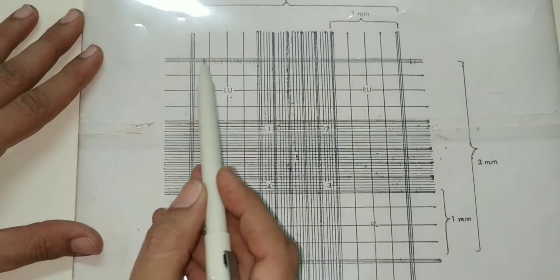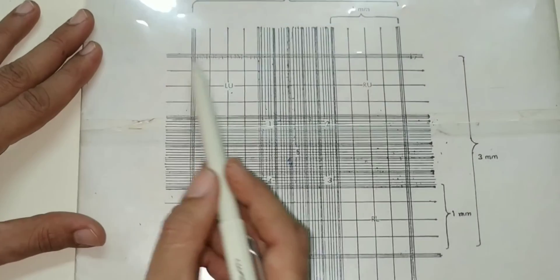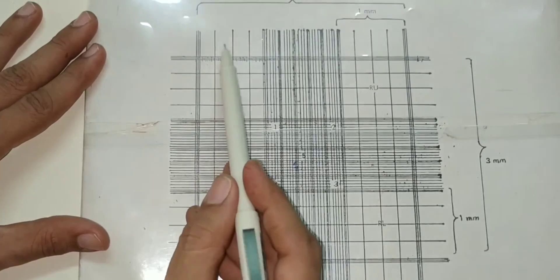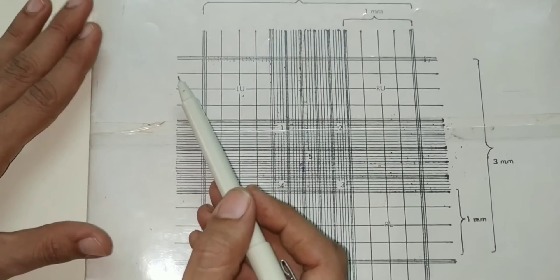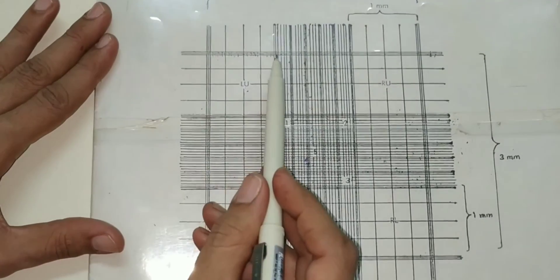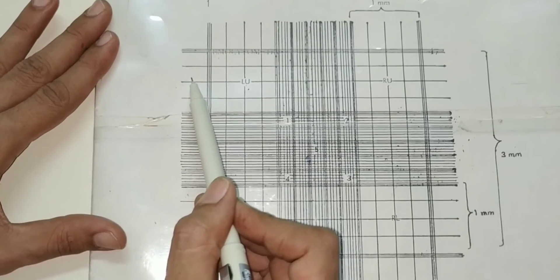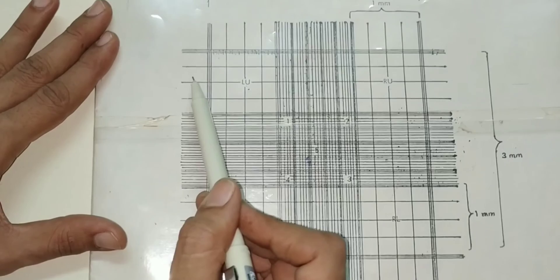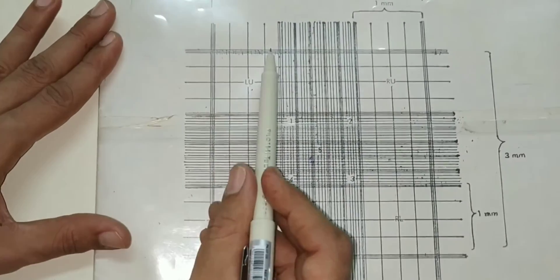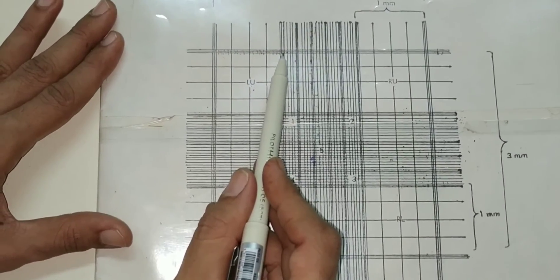Now we come to the WBC counting square. The area of each WBC counting square is 1 mm × 1 mm. The volume of each WBC counting square is 1 mm × 1 mm × 1/10 mm, since the depth of the chamber is 1/10 mm. Therefore, volume of the WBC counting square is 1/10 cubic millimeter.